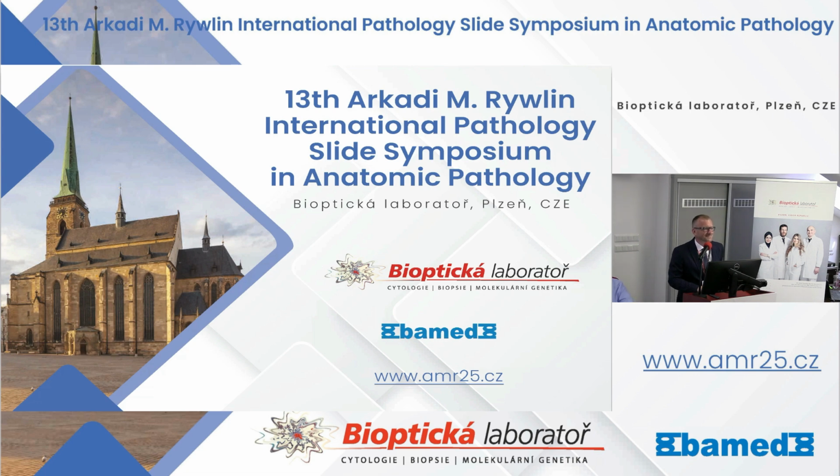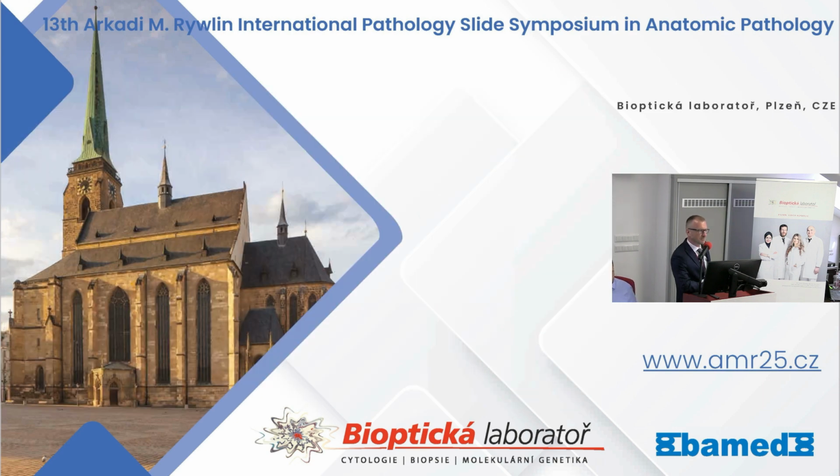Hi, excellent presentation. Regarding prostate biopsies, what about other types of tumors? So first question, yes. And another one, seminal vesicle tissue in core biopsy. Yes. So seminal vesicle tissue, completely benign. The system knows how it looks, and there's no trouble. But rare carcinomas, that's something different.